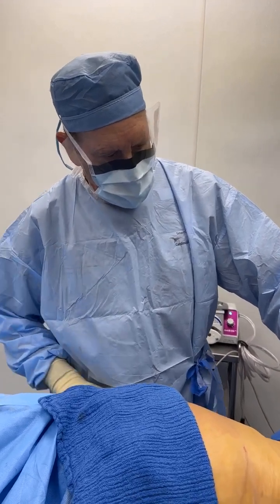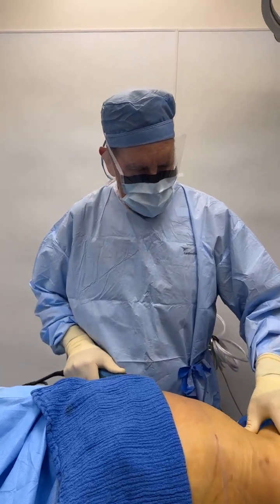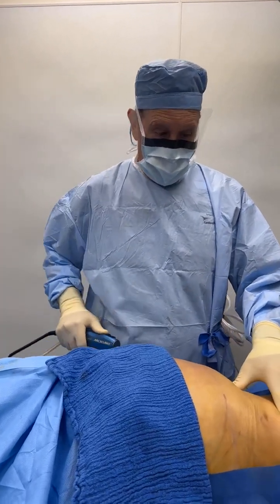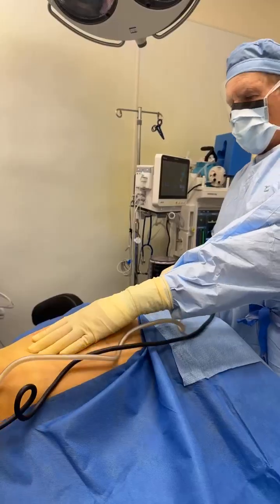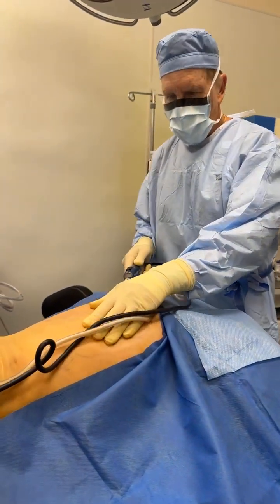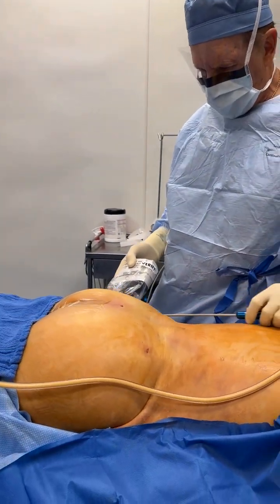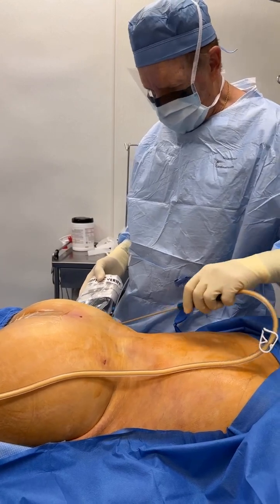We have workshops so you can come learn how to do this — not only to have less complications, less risk, less pain, less bruising, less bleeding, less risk of oil cysts, less risk of blowout fractures, less risk of internal injury. We never had any internal injury to any patient, thanks to God, and we want to keep it that way. Also less injury to the doctor, less risk of tendinitis and tennis elbow. This aspirate is a beautiful pale yellow, almost white — incredible. We're doing this under ultrasound guidance, and this fat has not been processed in any way. It is pure fat.